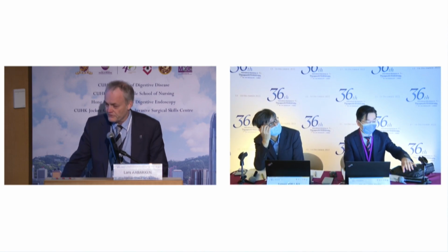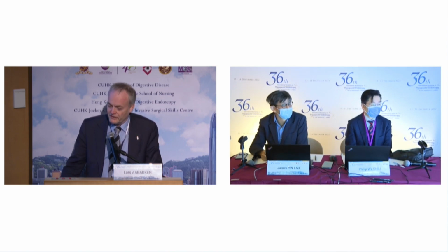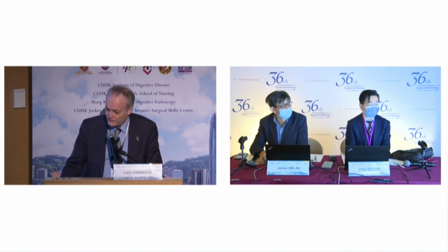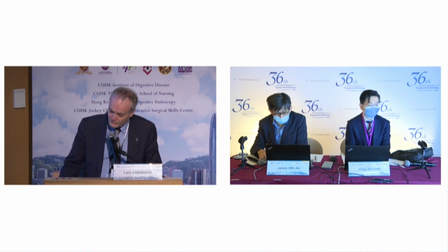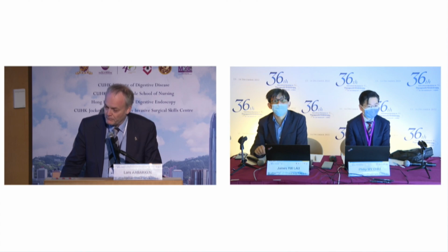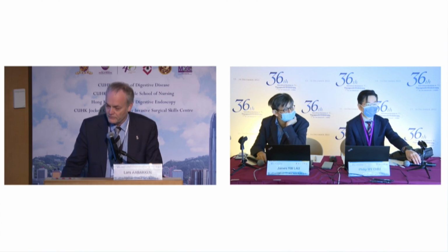Well, that's an excellent question, and like I mentioned, this is work in progress. We sometimes see changes which we think very much look like cancer, and there are some obvious features which make that quite clear. But like I said, for example, the effects of stenting are sometimes not quite clear. And I think some inflammatory changes as well can mimic cancer. So at the moment, similar to what we think about other lesions, I think we rely primarily on the biopsies. And then over time, probably we'll get better at assessing the visual aspects as well. But at the moment, I would be very careful to coin a malignancy based on the visual appearance alone.